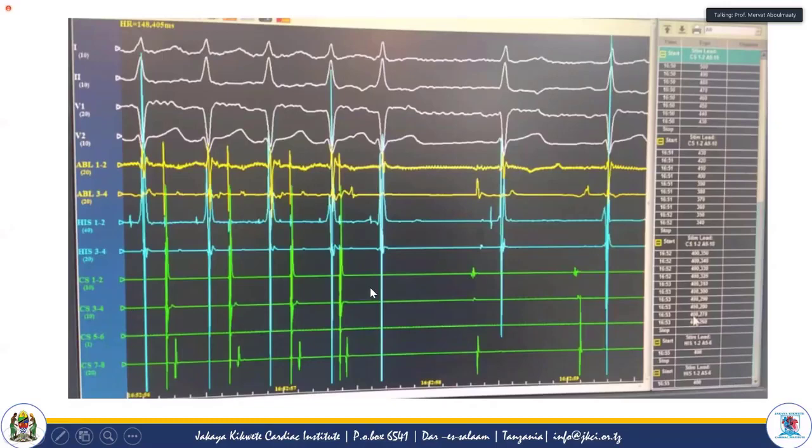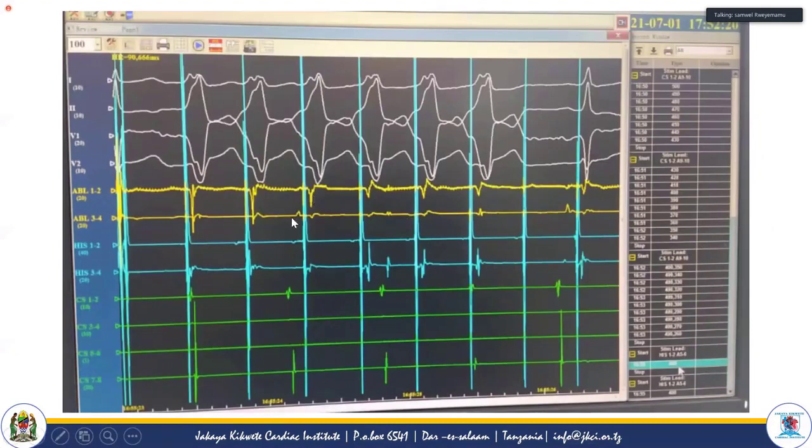Now you can show us the V pacing after ablation, Gandhi. Okay, V pacing after ablation is this one. So here, carefully when looking at it, what you find, for example, this is actually ventricular. You are pacing from the His that is actually in the right ventricle. That's why you get wide QRS complex. So tracing from there, you find this V that's followed by A. This V that's not followed by anything. Then you have V there. So there is a VA dissociation, you are no longer conducting from the ventricle to atrium. That the accessory pathway is successfully ablated.